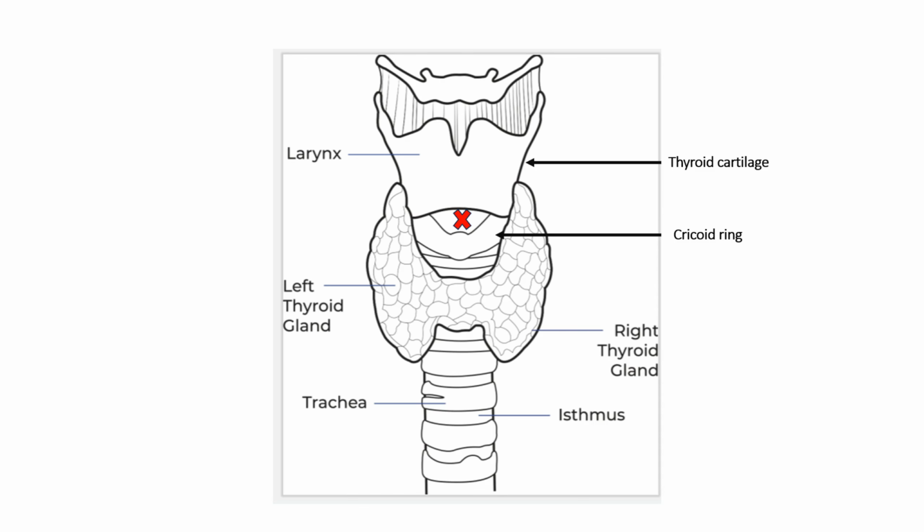What's described is that with your non-dominant index finger, which would be my left index finger, I palpate the anatomy to identify the cricothyroid membrane. That's the membrane between the thyroid cartilage and the ring of the cricoid cartilage. Then with my dominant hand, my right hand, I hold the scalpel and make a 4 centimeter longitudinal top to bottom incision over the area where the cricothyroid membrane is. It's a big incision so that you have space and access.